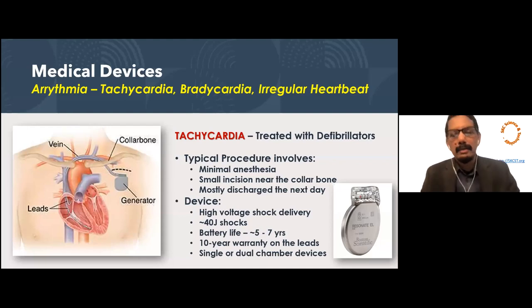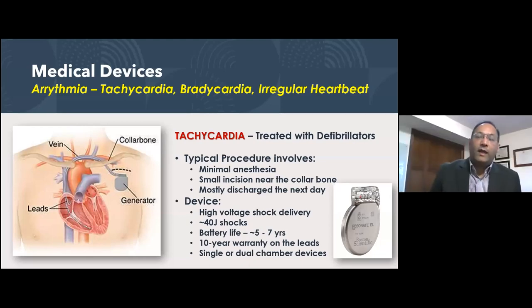Reza, with remote technology, when was the first time the remote wireless thing was introduced beyond clinical trial in actual patients? How recent? Yeah, so inductive telemetry, which is where the first remote programming came from, has been there since the early 90s. But the RF technology actually came in the first decade of this century, so maybe around 2004, 2005. And Bluetooth is around 2012, 2015.